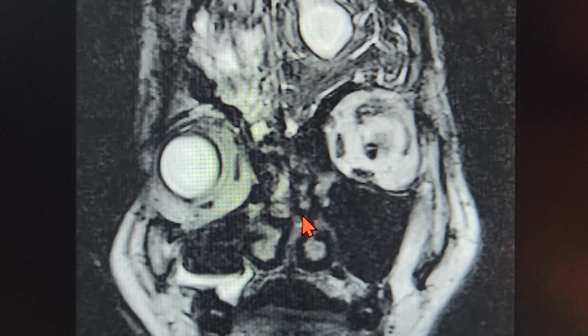And later on, I'll also be showing how I have used a navigation system for this case. I'll be showing you certain images and video clips of me using the navigation system, and how to differentiate the cribriform area from the anterior inferior frontal wall, that is the frontal beak, while performing the drafts. So I'll be showing you the basics of navigation system use as well. I'll shift to the video right now.